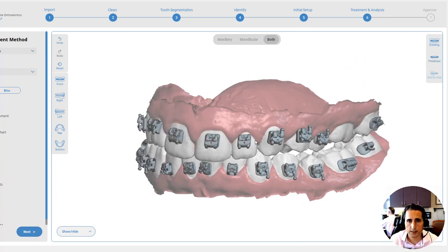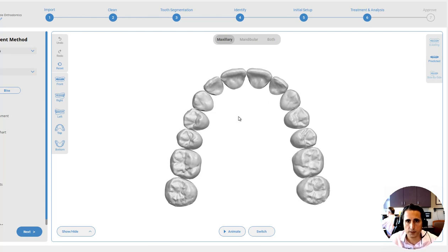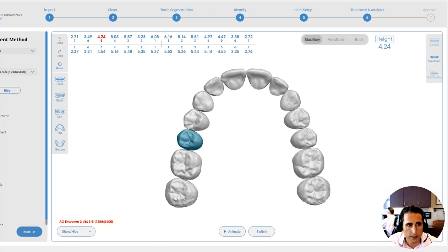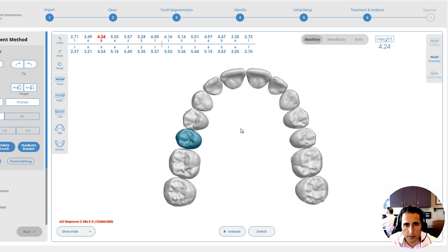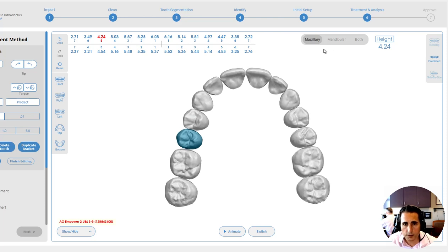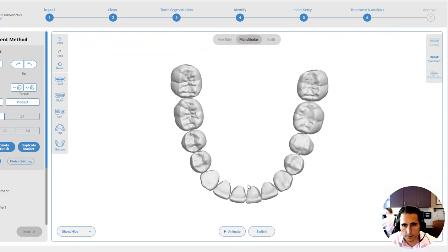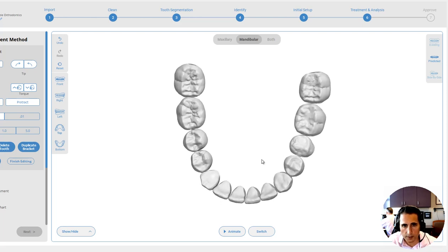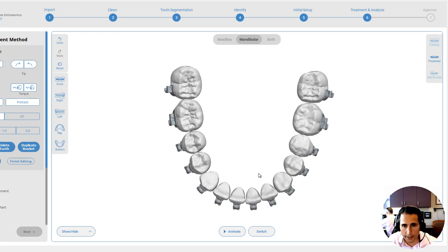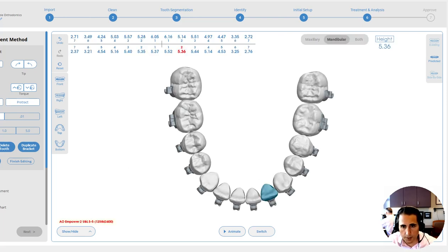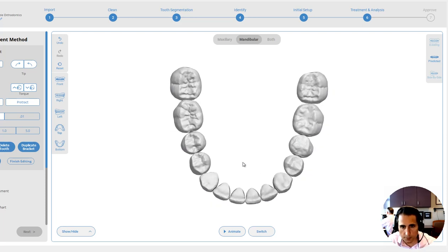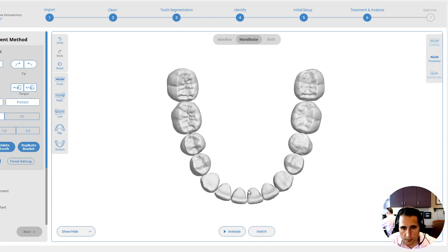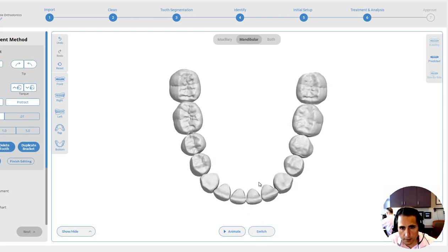Now we'll go ahead and take a look at the predicted outcome. I'm going to take the brackets off. The first thing I always do is look at the arch form and make sure the rotations are dialed in as ideally as possible. If they're not, we'll go ahead and adjust and rotate those out. Those rotations look good, so we'll do the same thing on the lower jaw. The anatomy on this is a little bit different, so we'll have to figure out the best position for that bracket. I'm seeing a little bit of rotation here, so we'll normal rotate it. If you hold the shift key and rotate, it's going to make a little custom pad where the bracket comes off to give us that better rotation.